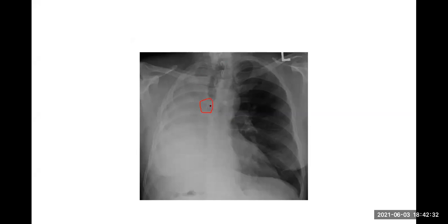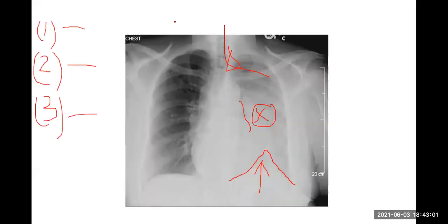Sharat is asking, why does the trachea get pulled to the same side? Why, Sharat? When the lung collapses, it pulls the trachea. With the volume loss, the mediastinum is a very elastic structure. When there is volume loss on one side, the mediastinum is pulled to that side. That is why. Okay, fine. And then you see in this one the surgical clip, so it is probably a pneumonectomy more than a collapse. But sometimes it is very difficult to differentiate. So I have told you three differential diagnoses of a whiteout on one side of the lung.